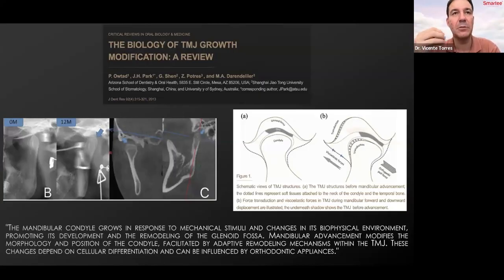And sometimes to put this kind of mandibular advancement with an increased overjet in a patient 68 years old, maybe we can complicate the lifestyle. So sometimes maybe the oldest patient that they have with this GS package is 53 years old and is working really good. But normally you need to understand every case.